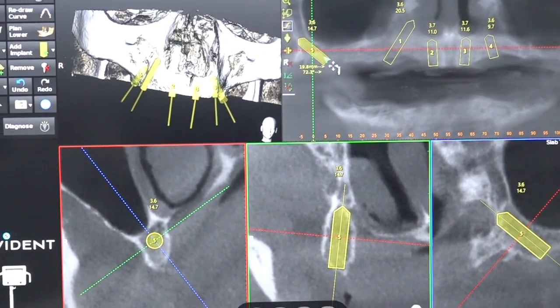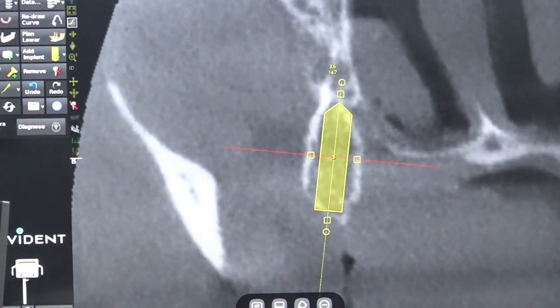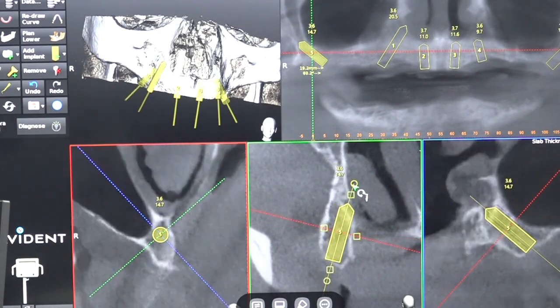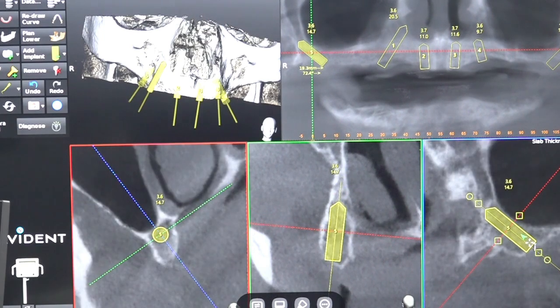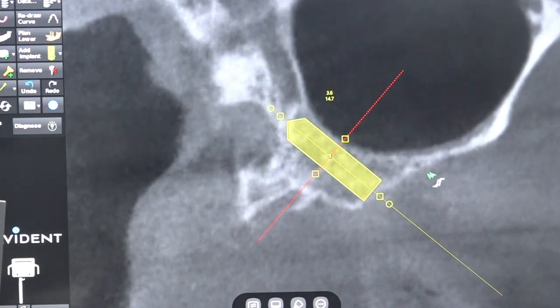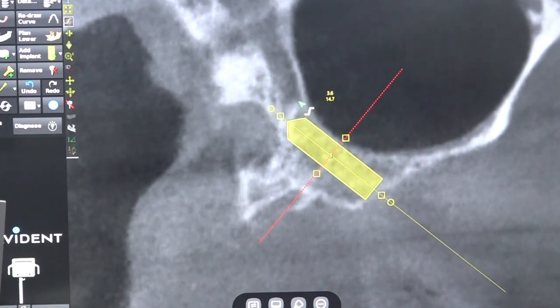First we will see the right pterygoid as usual. So this is the anatomy of the right pterygoid. Crest of the ridge, sinus expansion, very much distal. We can see the very wide radiolucent pattern here. That is a descending palatine artery, which will come out as the greater palatine foramen and artery. Here it is too much close to our target area.